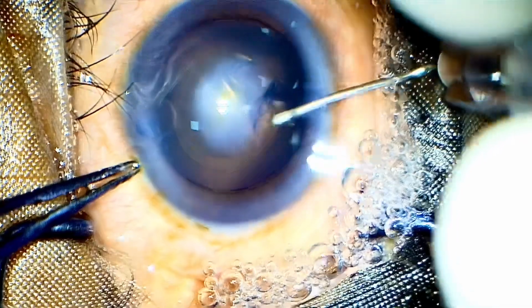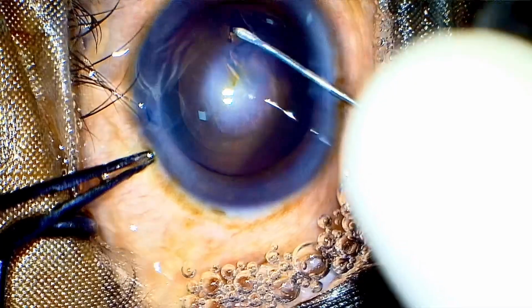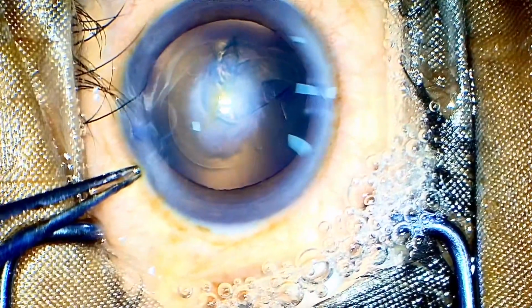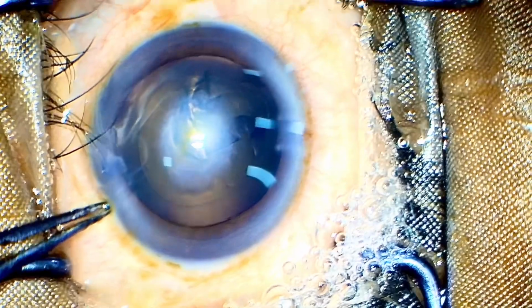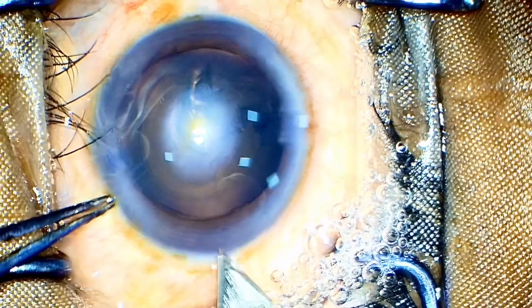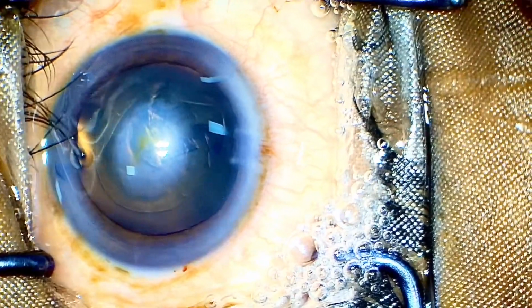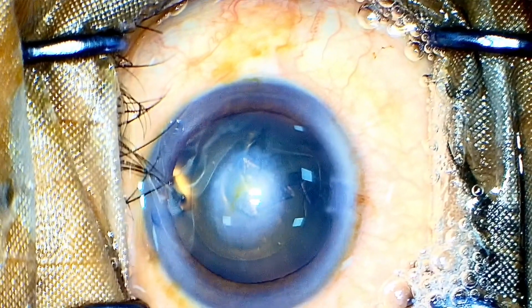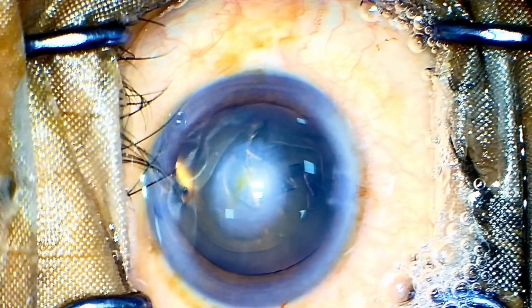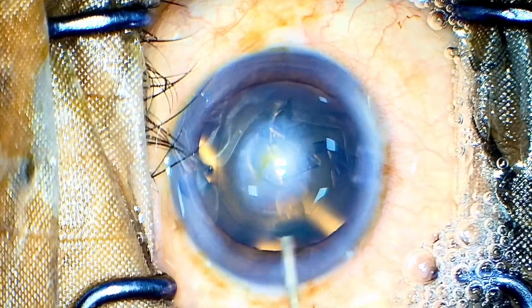One is always stay in the capsule in these cases, because these young patients tend to have a very elastic capsule which is prone to rip apart. So yes, I have dyed it with trypan blue and I have completed the rhexis going around the periphery of the corneal opacity. All the other steps will be similar to my other cases. I have made two side ports, limbal in location with minimal blood vessel cut, and a main port that is around 2.8 mm in width.